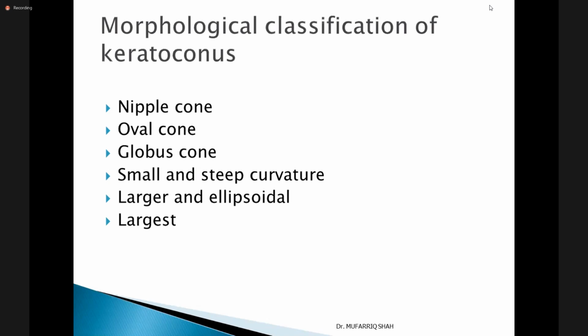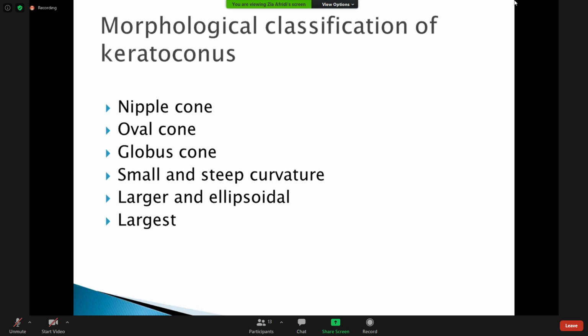First you must know which type of cone this is, because for every type of cone there is a separate kit of Rose K family RGP lenses. You can know the type of cone through clinical examination or through corneal topography. The most reliable with respect to fitting of RGP contact lenses is the corneal topography.